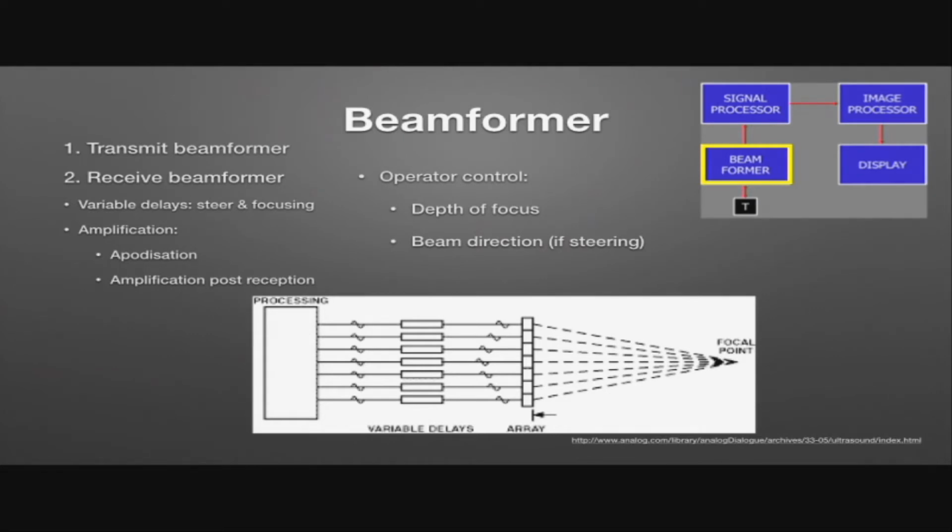Just to recap, dynamic focusing was the automatic electronic delay that happens to compensate for the delay in returning echoes from different depths. That's an automatic function. You don't have control of the dynamic focusing. You do have control of the focus position on most machines, and that's going to be directly related to some of that variable delay.